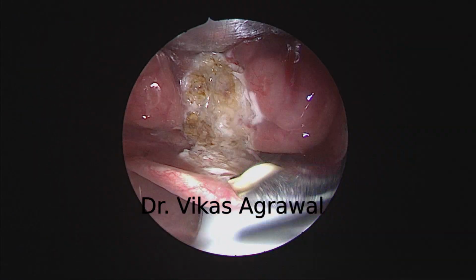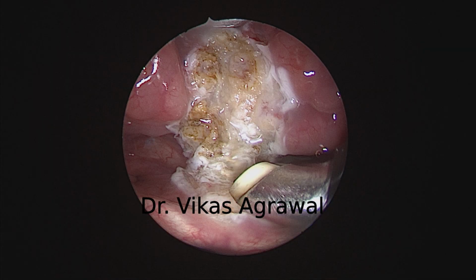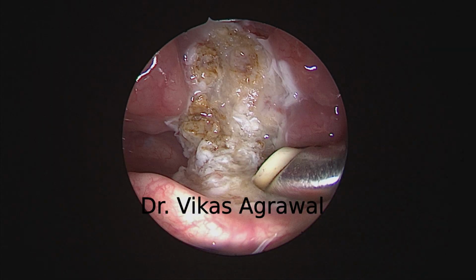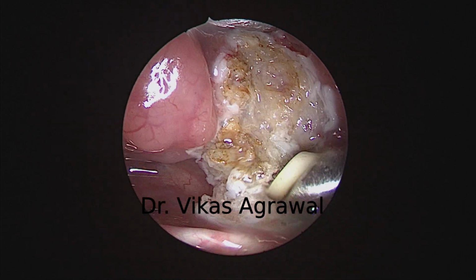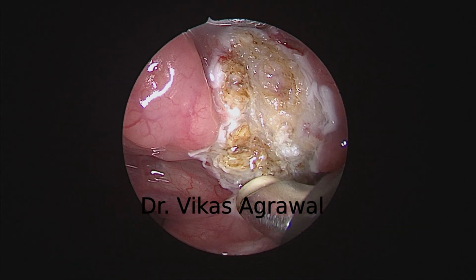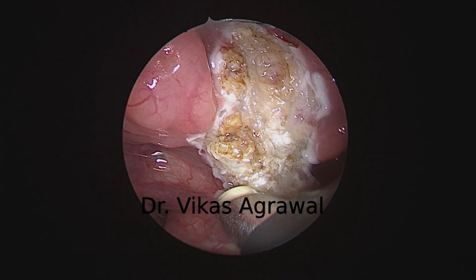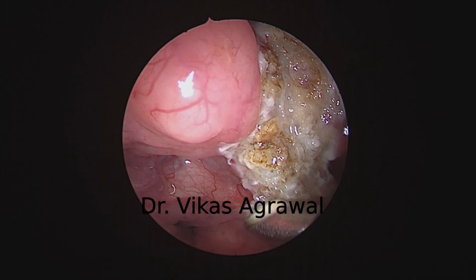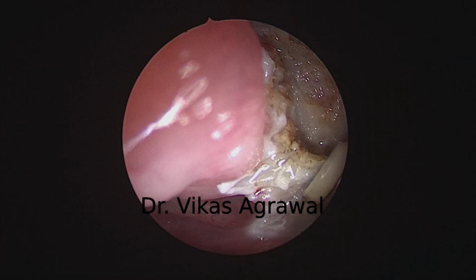All right. So I'll just give a little bit more extra energy into this area, because this is where we want maximum fibrosis to happen. Just going a little bit laterally, and that's the vessel. So I'll remain away from the vessel, just coagulating a little.